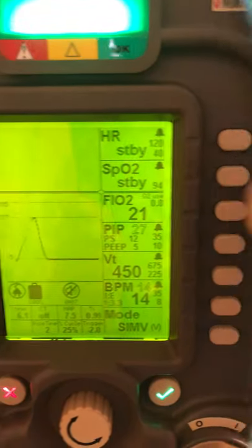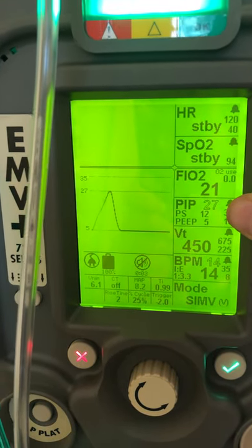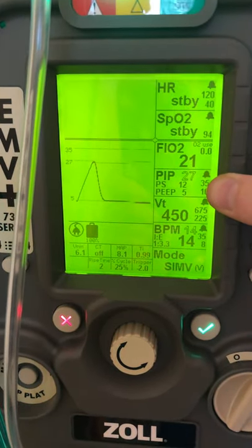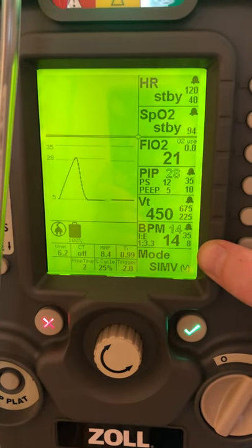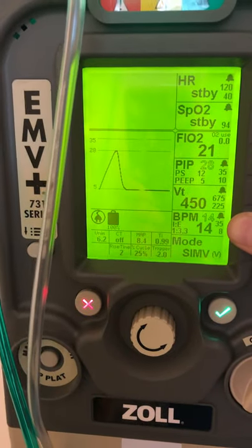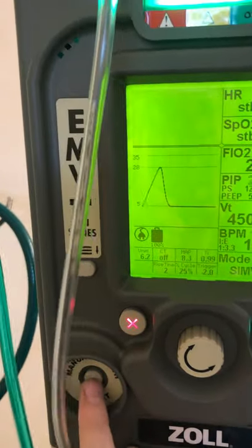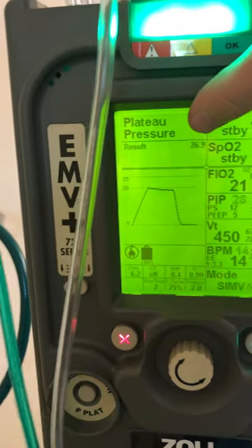I also want to call your attention to the screen — you can see different values here. Look at PIP — it says 28 in a hollow number, that's the measured value. Same with respiratory rate and breath per minute — we see 14 in dark black and 14 outlined, that's our patient value. If you want to check a plateau pressure and you know how to use that, you use this button down here: while the patient's breathing in, hold it down, release, and it will tell you your plateau pressure. That's for volume control.